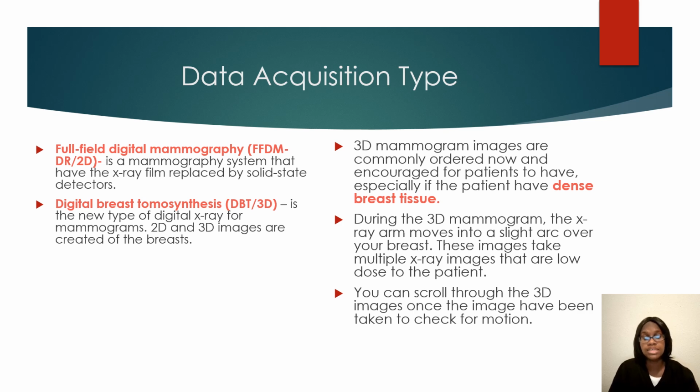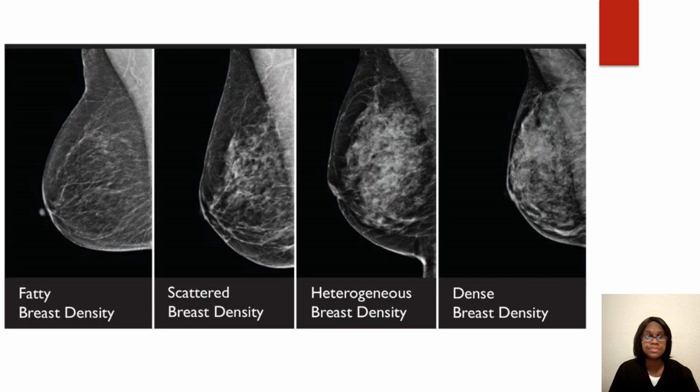That is the new type of digital X-ray for mammograms, and especially for patients with dense breast tissue, 3D mammograms are encouraged because they can see through the breast tissue better, and it helps avoid the patient having to come back for more follow-up. So I always recommend or encourage my patients to have a 3D mammogram whenever possible. You can also scroll through the 3D image to check for any type of motion to avoid the patient having to come back to the facility.